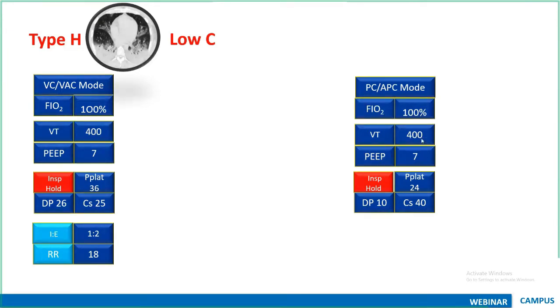So in this group of patients, when you are ventilating, you can accept a reasonably good tidal volume, and again you can accept high FiO2 levels. Don't try to target an FiO2 of 60 in this patient. You can keep titrating FiO2 for a saturation of somewhere around 90-92, but not more than 92. So try to keep a minimum FiO2, but don't try to recruit this patient.